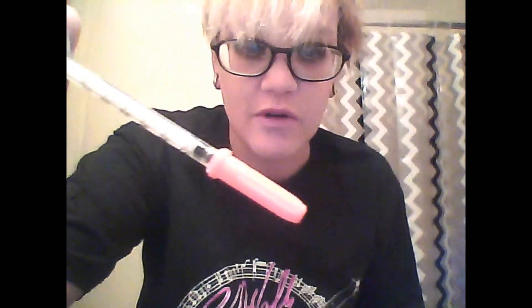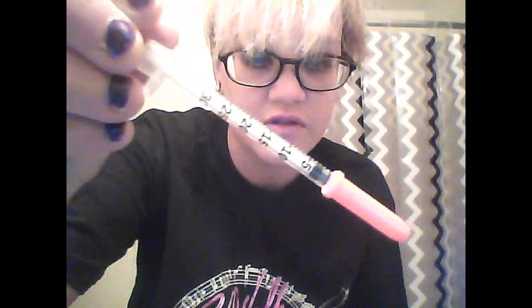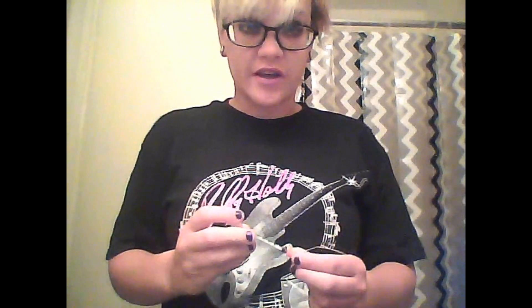These are the syringes I use. They're the smallest needle and the smallest amount you can hold, which is 30 units. Usually I take about 30 to 40 units per day depending on the day, what I've eaten, and how much I've exercised. Here in Texas it's about dinnertime in an hour or two, so it's time for me to take my insulin — I'm going to take 20 units tonight, but I just want to show you how I do it.